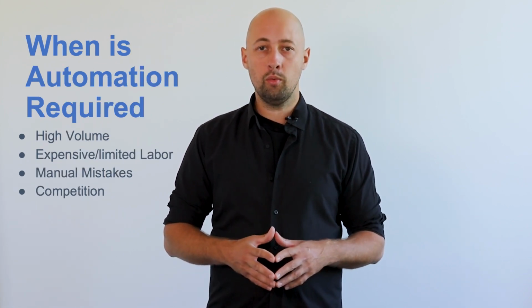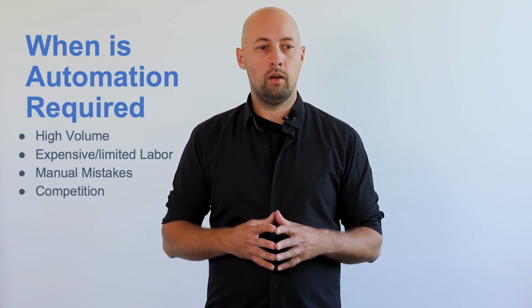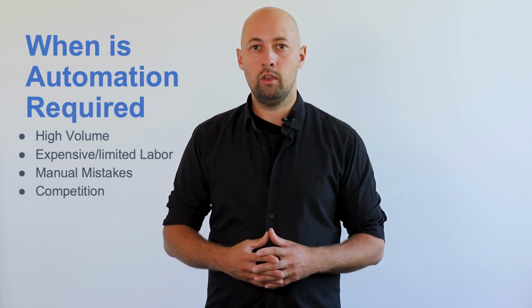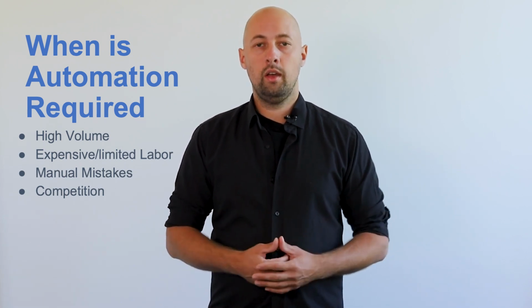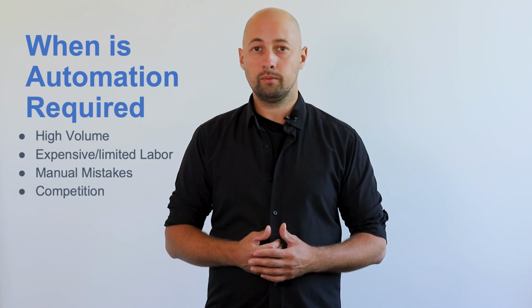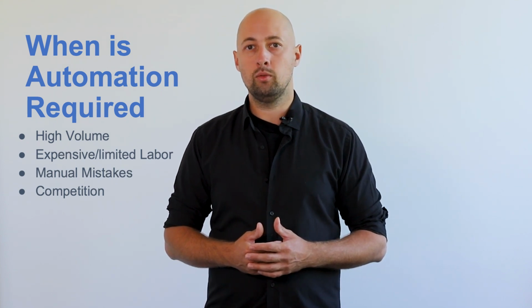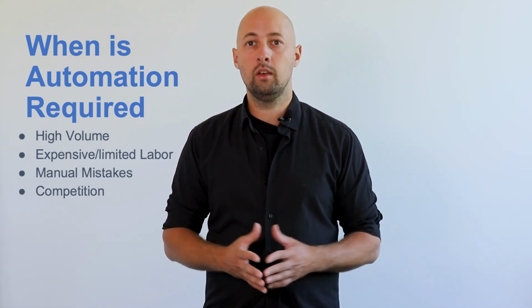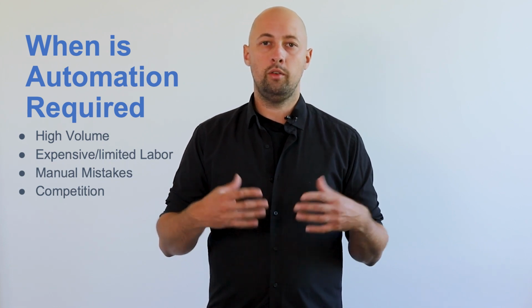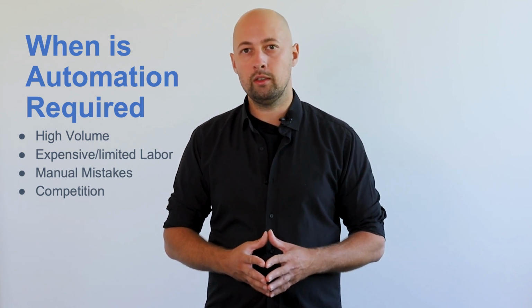And if you want to understand when we need the automation, usually it starts when you start to produce more and more aligners. So the high volume is definitely a precondition for the automation implementation. And also if you have the expensive labor force, or it's hard to find the skilled dental technician or any kind of dental technician, it also makes sense to implement some of the automation techniques. So you have more machines and less people working for you, and that will also allow to reduce the level of the manual mistakes, because mistakes happen, and the only way to deal with that is to automate as many processes as you can.